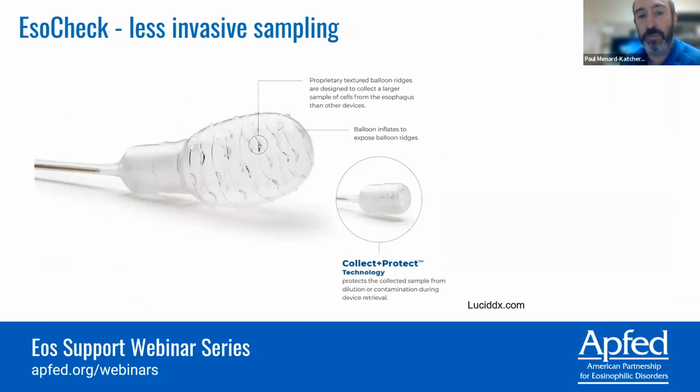minimally invasive sampling device. This is the EsoCheck. This is also placed transorally, unsedated, and can be done in the office. This is a product from Lucid Diagnostics. And essentially, in that bottom right picture, you have a deflated balloon that is placed into the esophagus, into the stomach, and then the balloon is inflated and has ridges that, when the balloon is pulled up into the esophagus, sample the esophagus.